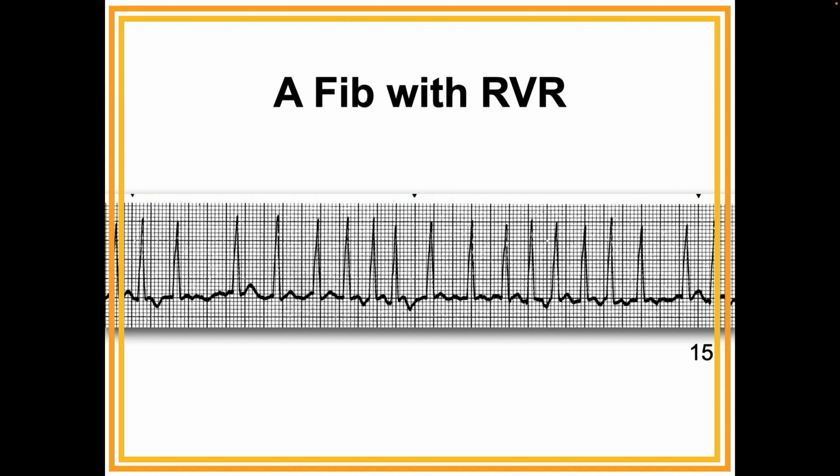If I say, what is this? And you say AFib with RVR, or tachycardic AFib, that's great. But if I say to you, identify this rhythm, if you say AFib, you're done in my book. Okay? And AFib is perfectly okay. In fact, a lot of times you'll hear physicians or cardiologists say AF. And I'm actually okay with that too.